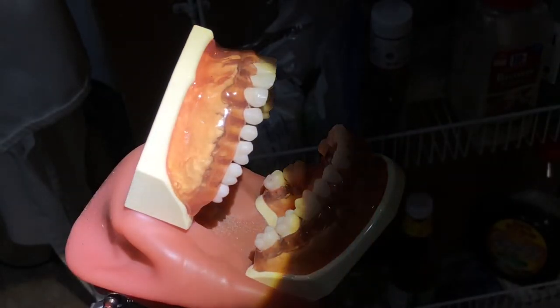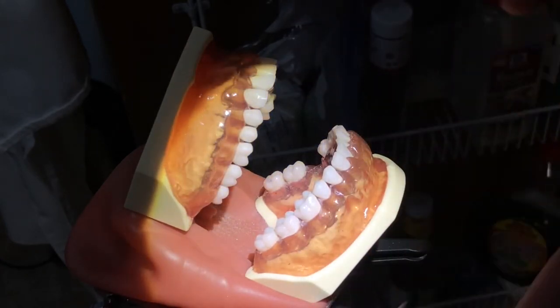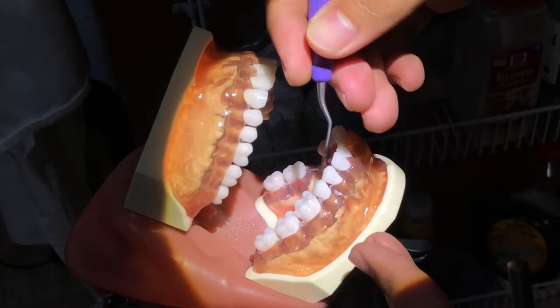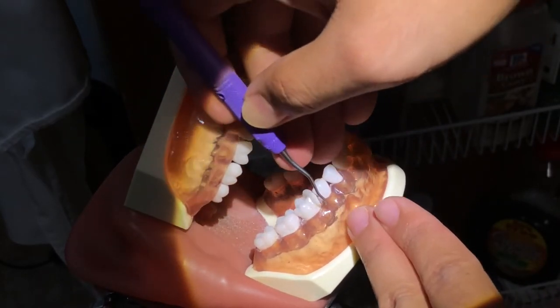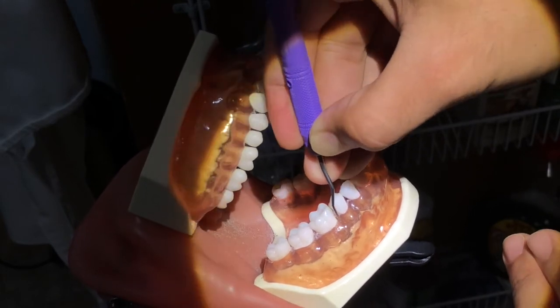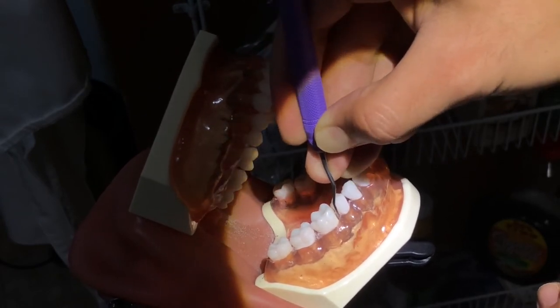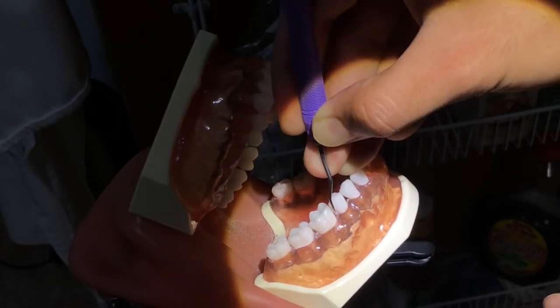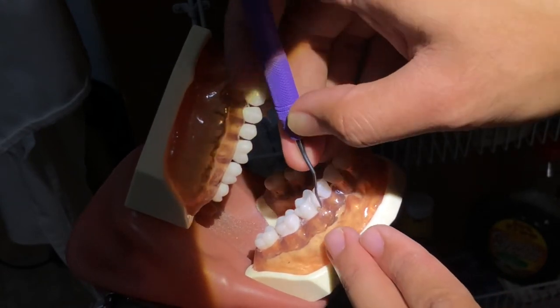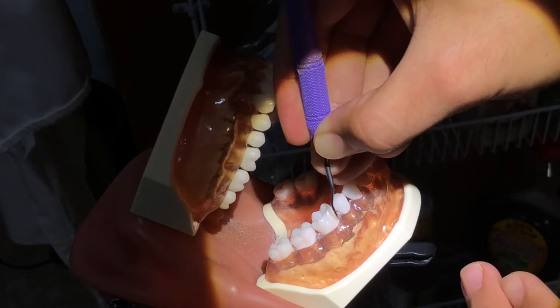Using a Gracey, I'll be instrumenting tooth number 30, mesial buccal. I have the Gracey 11-12 here. I'll determine the right cutting edge. Looks right. So first I'll insert, angulate, and then activating strokes.